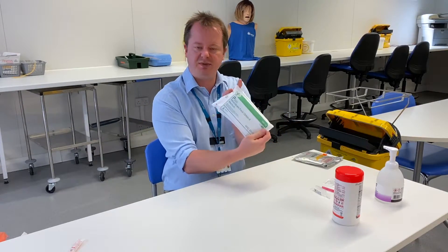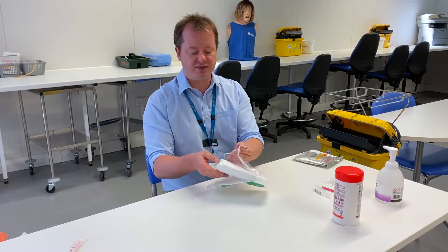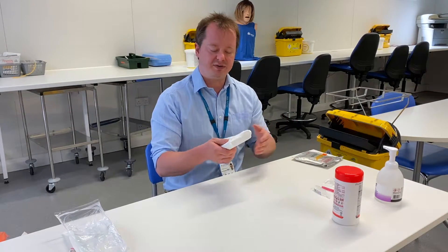In this trust we use a wound care pack, but each trust you go to might have a different version of this, or they might have individual packs for individual skills. You're going to be using this kind of procedure when it comes to catheterisation or things like that, which we're going to be learning later.